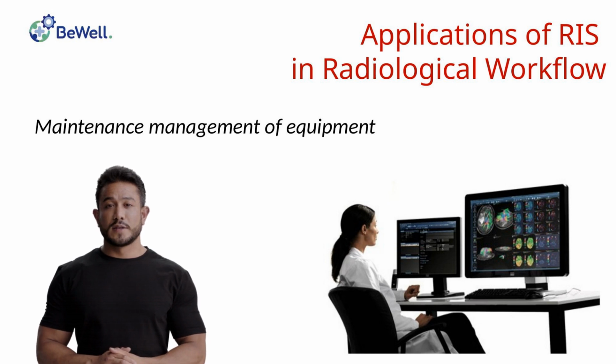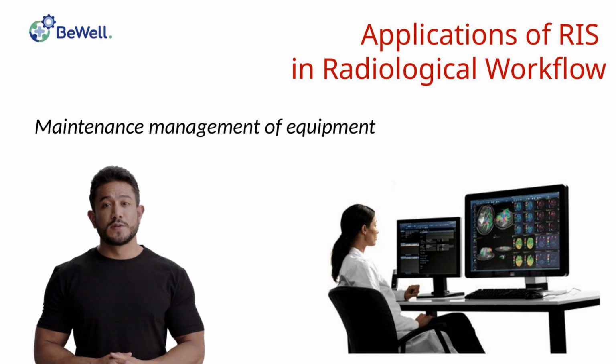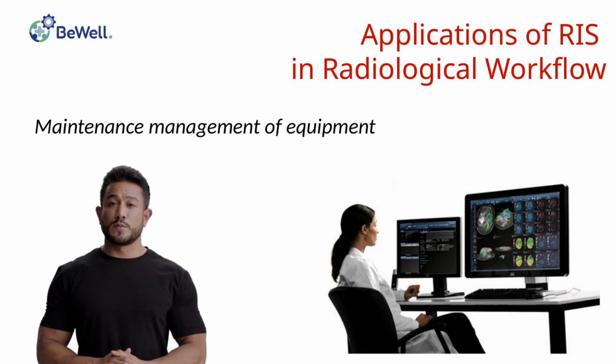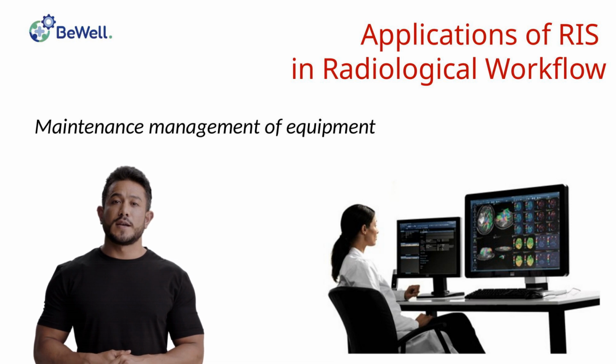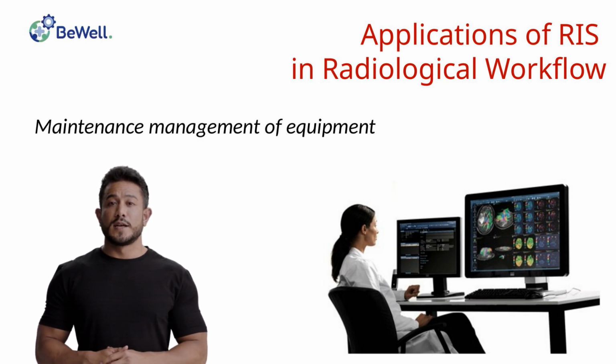Let's talk about maintenance management of equipment. A very important feature of the IS is its widespread distribution throughout the department, with a network of workstations accessible to all professionals. Therefore, among the functions that the IS can perform, especially considering the frequent interaction by the entire staff, an example of particular interest is the collection of information necessary for optimized management of the equipment present in the department, with a specific focus on maintenance monitoring.